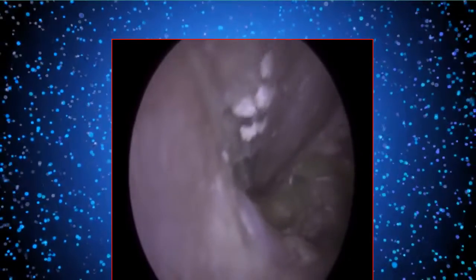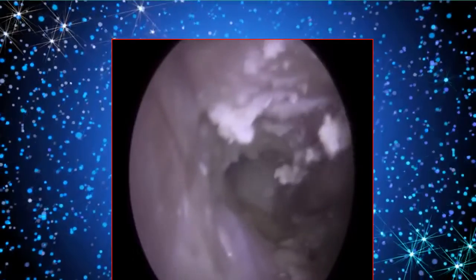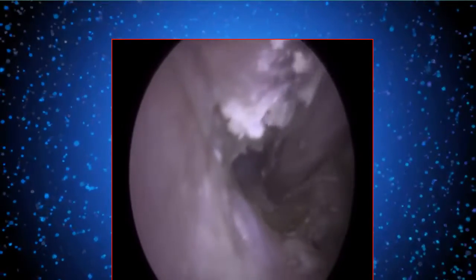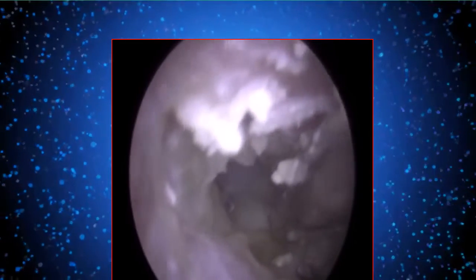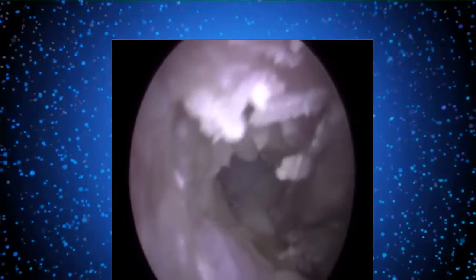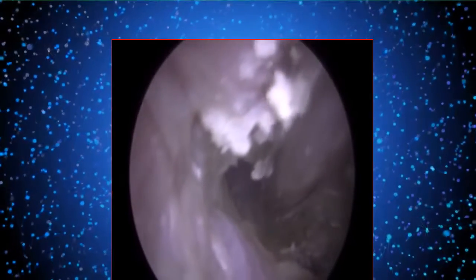was today, and I managed to clear a lot of debris, but there was this debris that we're trying to remove today that was impacted on the eardrum that I couldn't get access to. It was just not possible. The ear canal was too heavily swollen. The patient decided to come back to me personally to have it removed today, so that's not a problem.